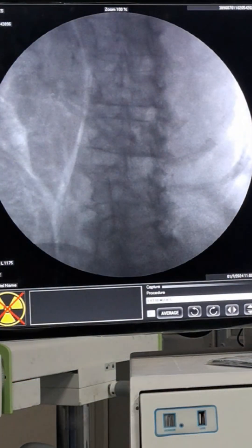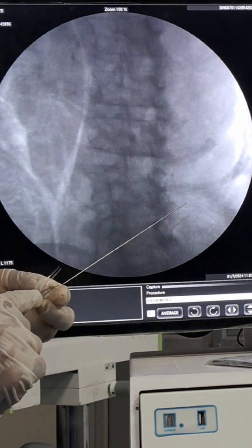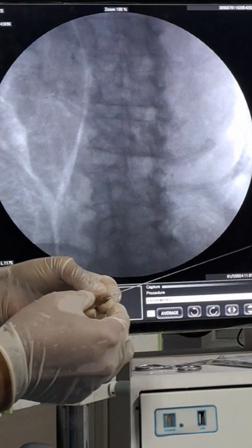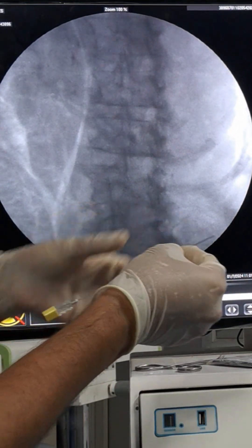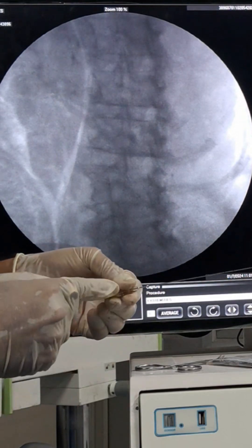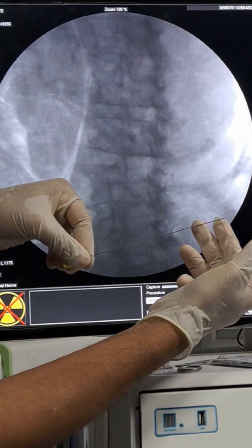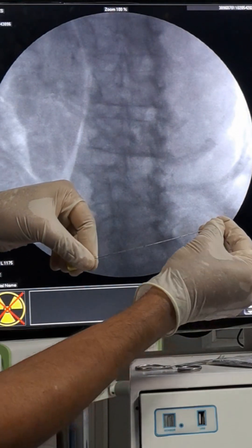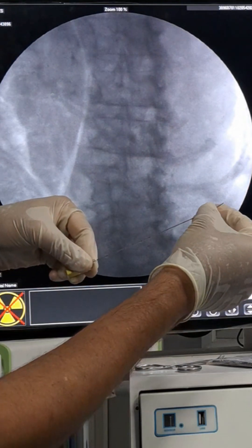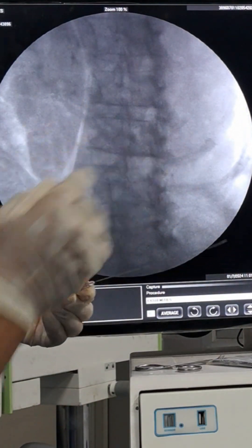I will use a fifteen centimeter needle — a ten centimeter needle will not work. Regarding bending: as the pointer shows the bevel, I hold the needle with the bevel downwards, then bend using the index and middle fingers, pushing with the thumb to bend the needle opposite the bevel. The bending should not be too steep — it should be a smooth bend so that you can maneuver the needle and reach the target.